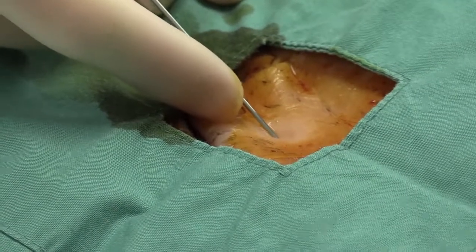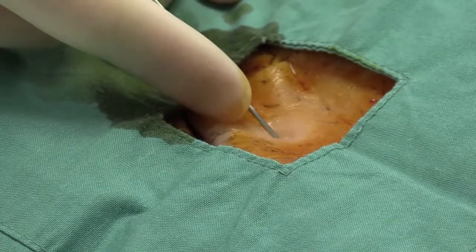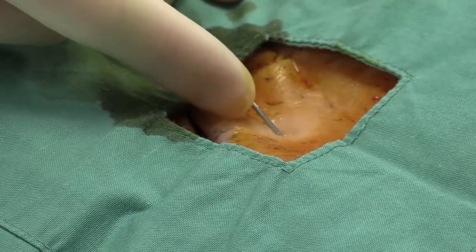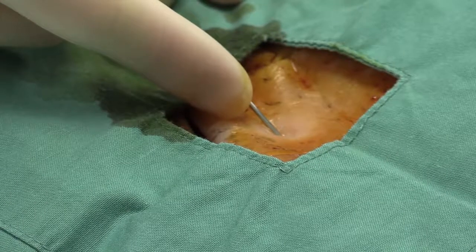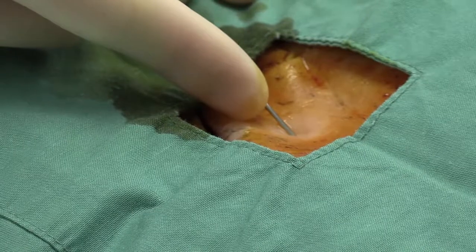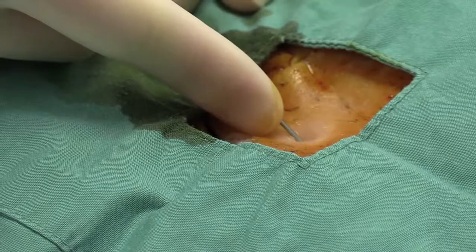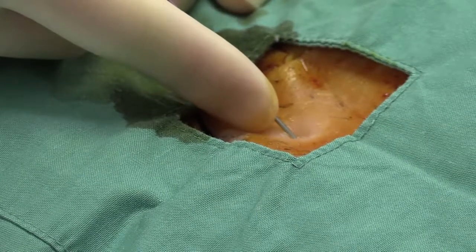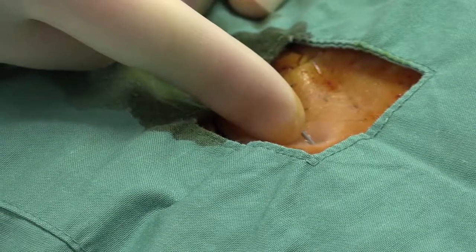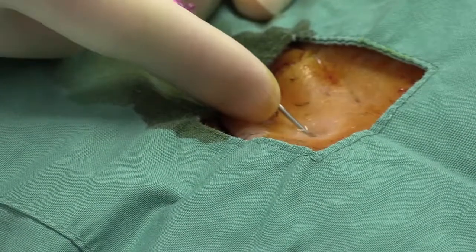allow the needle to tap down and feel the resistance of the sheath, and then with a finger advance down the needle shaft, we prevent the needle from plunging inadvertently into the abdominal cavity, and we apply gentle pressure, as stated previously, towards the coccyx. Once we feel the resistance in the tissues, that's the needle dragging down the fascia as it tries to puncture it, and there may or may not be a sudden give in the tissues as the needle traverses the sheath.